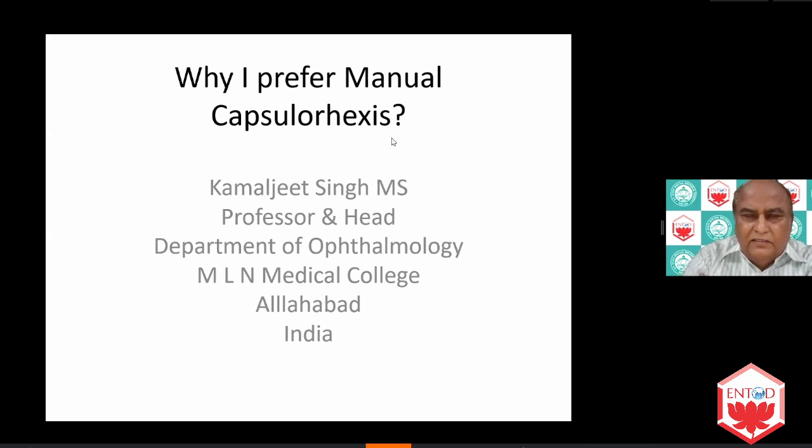So friends, it's a very, very important topic because, as Dr. Mohita has already said, the cost of the rexis should not increase. Normally we do around 100 cases, and still out of them, only 20 cases are phacoemulsification. The rest of them are manual small incision cataract surgery. So that is the problem, and we don't have one femto or zepto. And I know that all eye surgeons are so accomplished that they can easily perform 90 to 95% of capsulorhexis with the help of a needle or a utrata forceps.